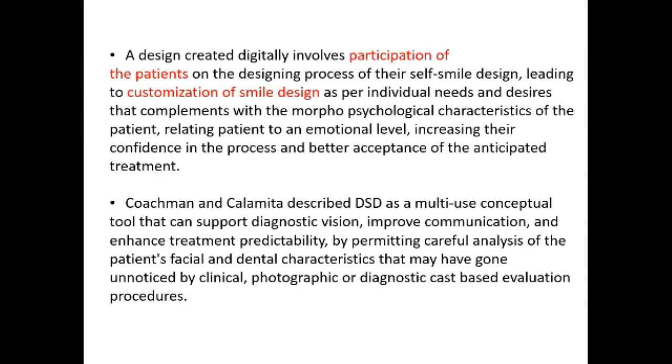Basically, we are planning to connect emotionally with the patient. Emotional connection will not come very easily. It comes with the patient's acceptance. It happens very easily with the help of a digital smile design tool. The patient will be able to emotionally connect with the clinician.